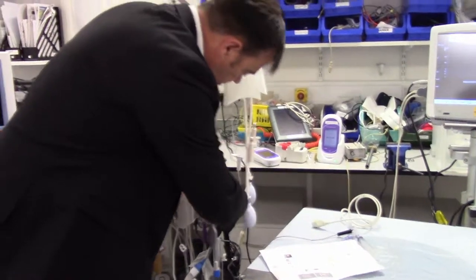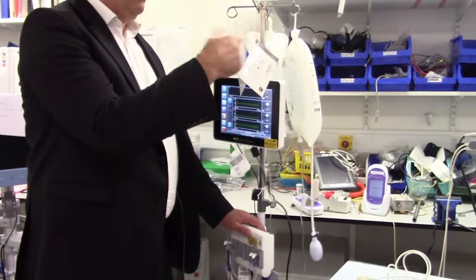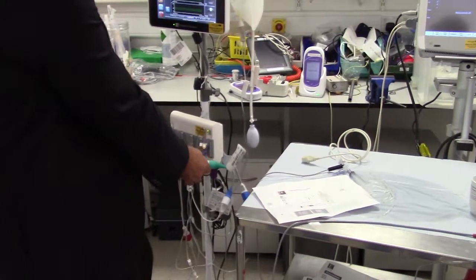Is that a weak point in the design currently? Yeah, if I had to point to one, that would be it. Occasionally it happens, not often, but then it's just a case of wiggling the connection around, and it sometimes improves and you don't have the issue. So it's the green to green that's the important bit.